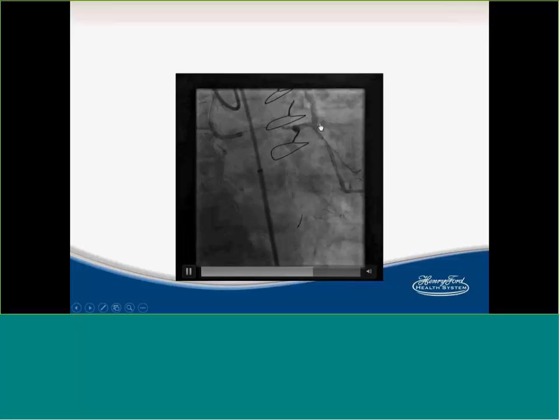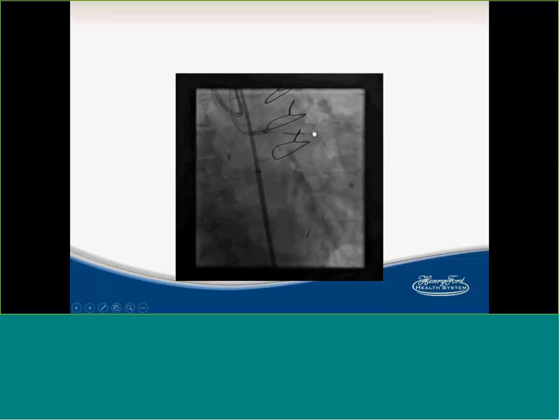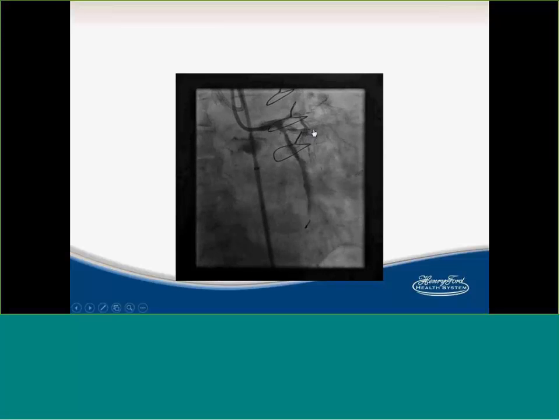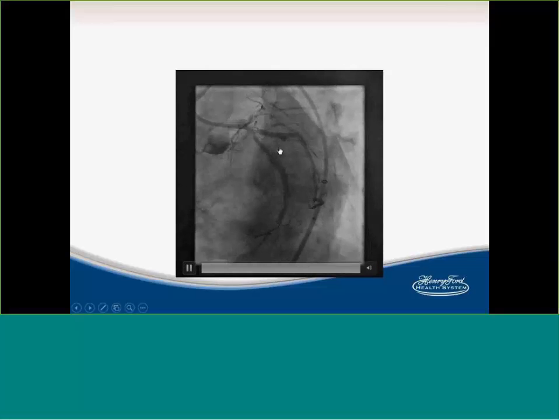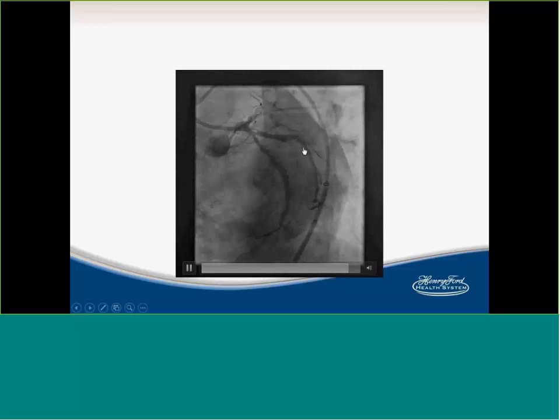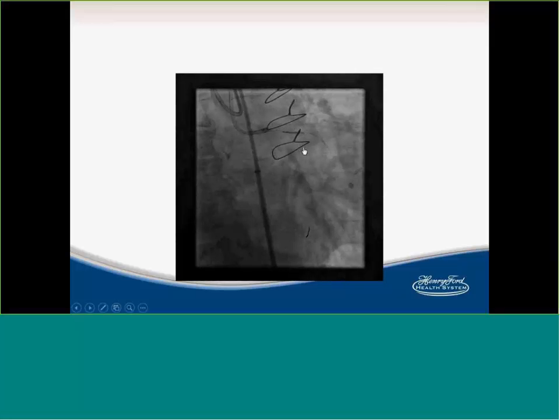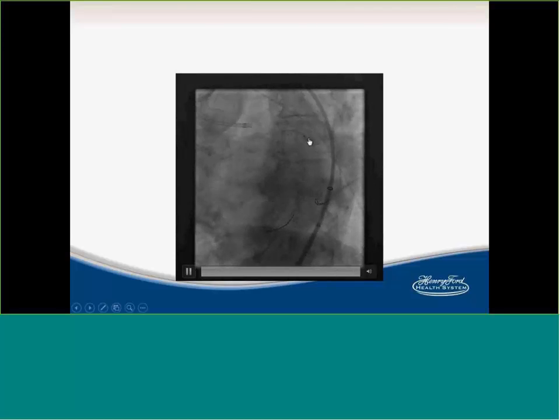This is injection in the graft. This is basically where I was struggling, where I had to destroy the vessel, and so this is a 4mm stent. We deployed that stent, and we deployed a proximal stent, and this is basically our almost final result. So here, this is 4mm. I went back and dilated it with a 4.5mm balloon because I want to jail that graft.